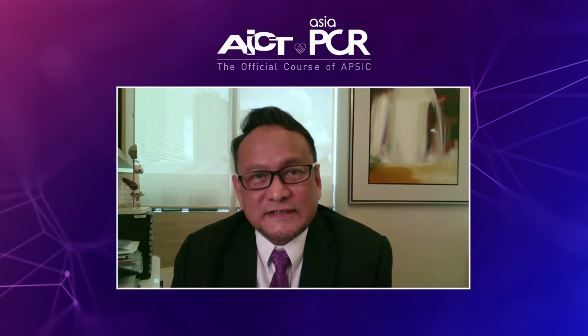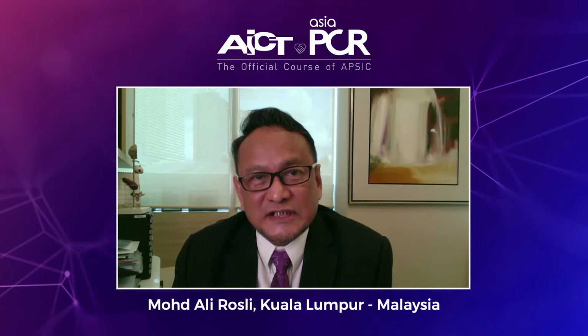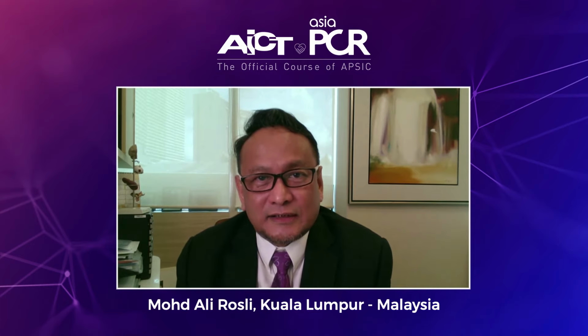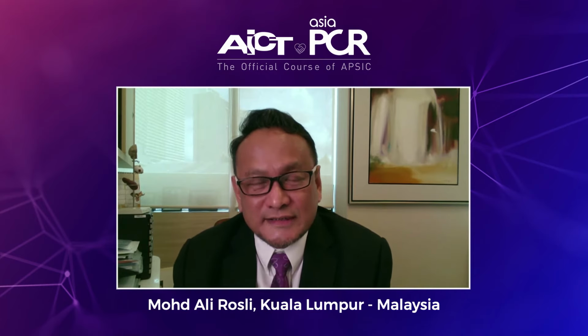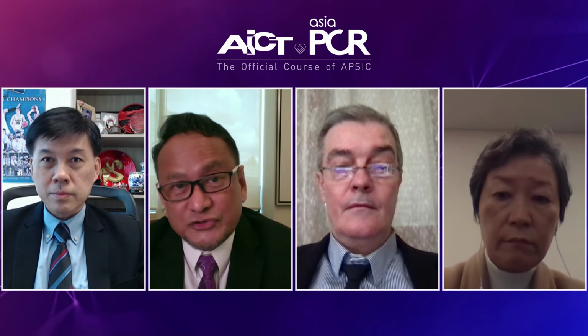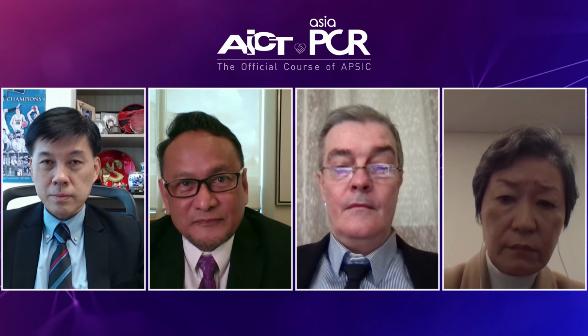Yeah, I think what is important is that the IVUS that you did did not show an extremely severe calcification. So it is not more than 270 degrees. With that, there's no indication of saying that we should use lithotripsy here, and I think it's not going to be useful for that modality. And you've shown that in your pre-dilatation, you get fairly good balloon expansion. So I think we can avoid using that technology.